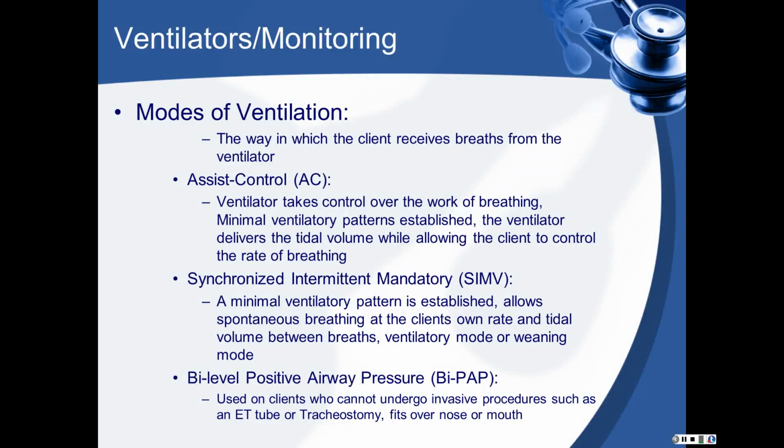Your BiPAP provides for a non-invasive pressure support ventilation. This is usually done via nasal or a face mask. It is used for your clients who cannot undergo the invasive procedures such as an ET or tracheostomy tube.